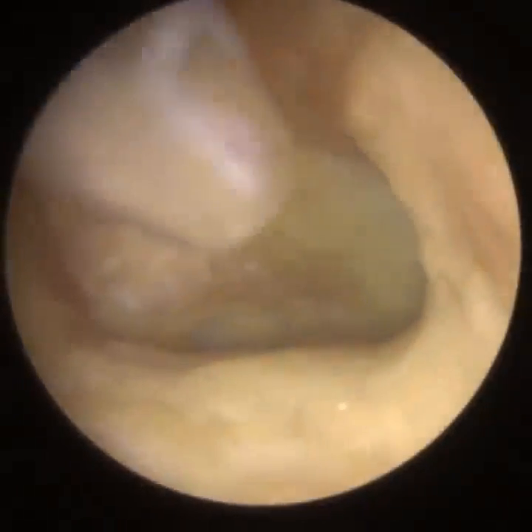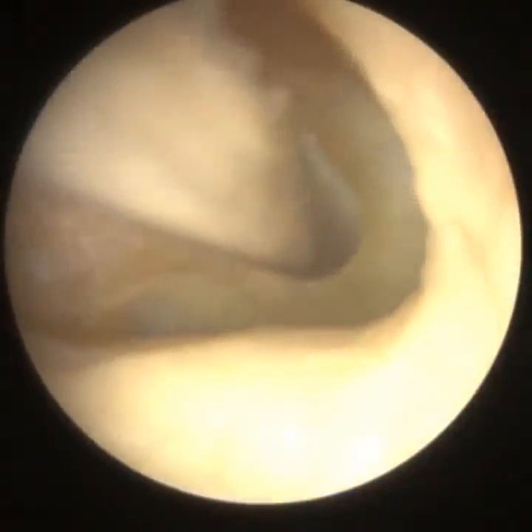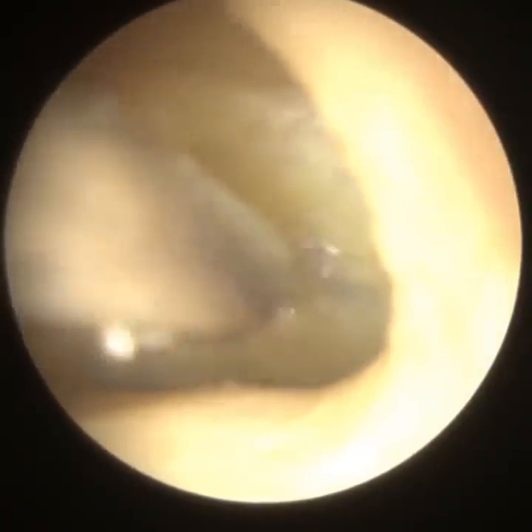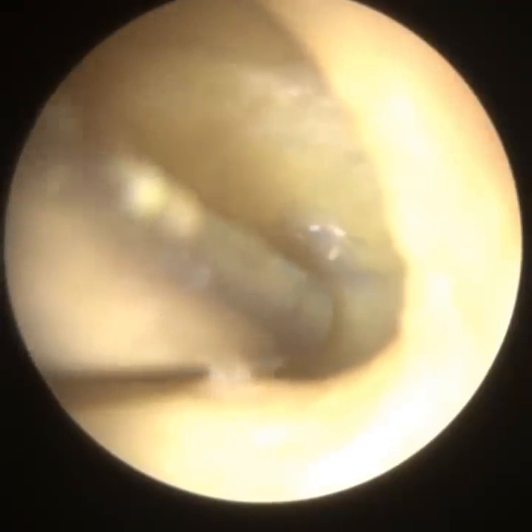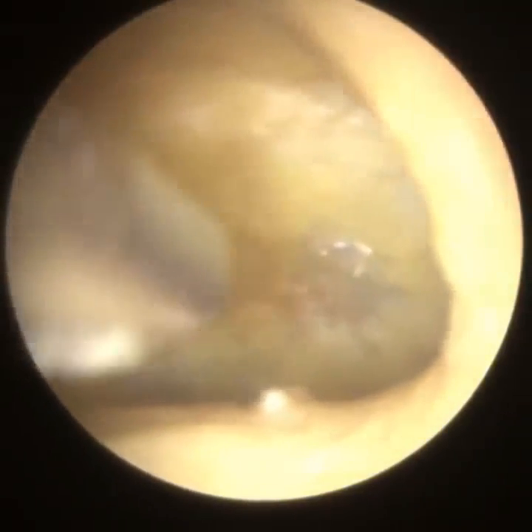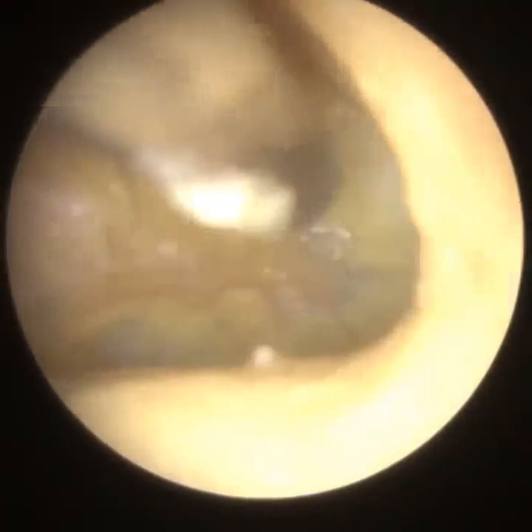So, a very interesting case of a gentleman who travelled from Wakefield, Yorkshire. So it's around, I would say, a 5 or 6 hour round journey. He came a few weeks ago; I've just not had time to upload the video. He was suffering from a blocked left ear, and he visited someone local to him in the first place who advised the patient that they had a double ear canal.